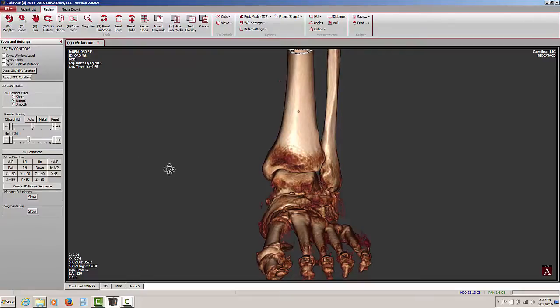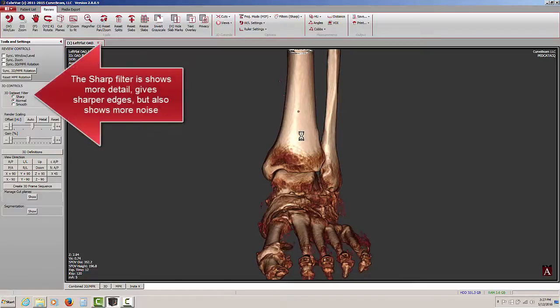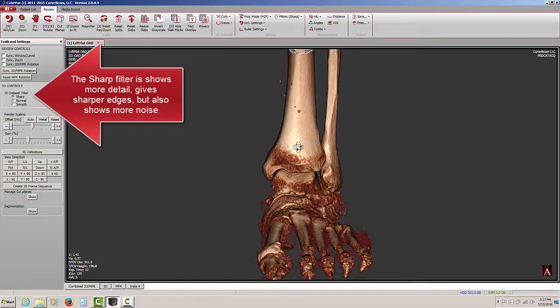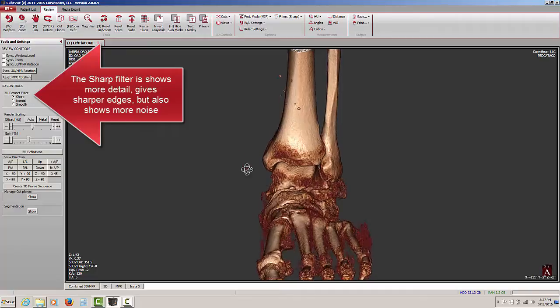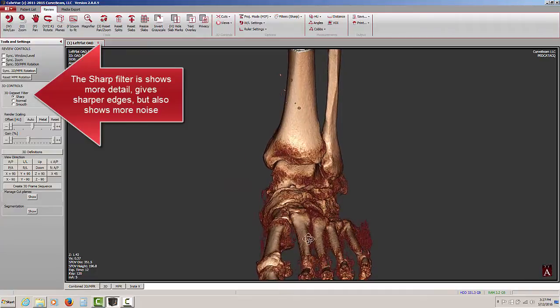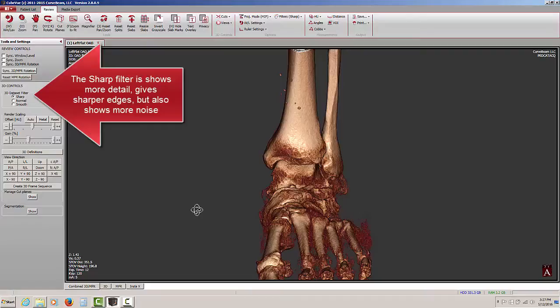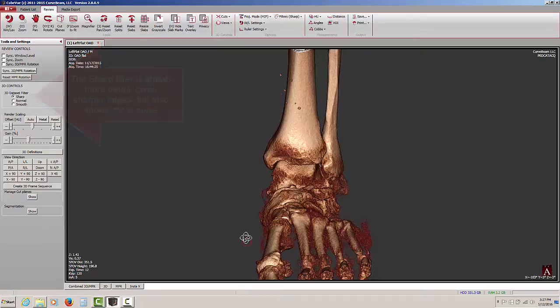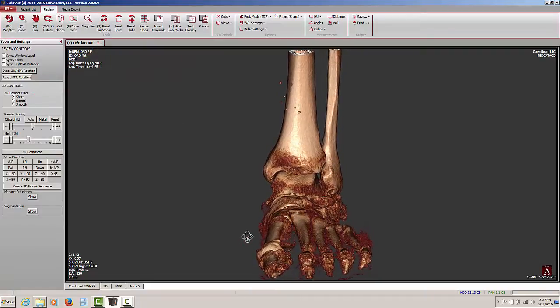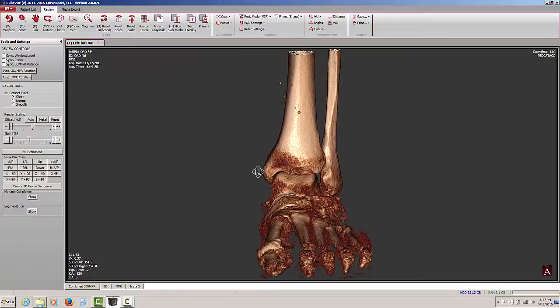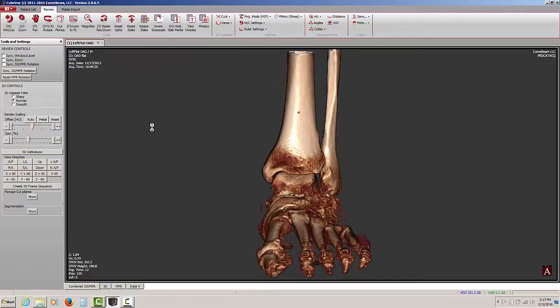This again is normal, the default appearance. And then if we go to sharp, we can make out considerably more detail, but we'll also see more noise, such as between the toes and also what you would see between 2 feet. So the recommendation, unless you're looking for detail on the surface of the bone, is to keep it on the normal filter.